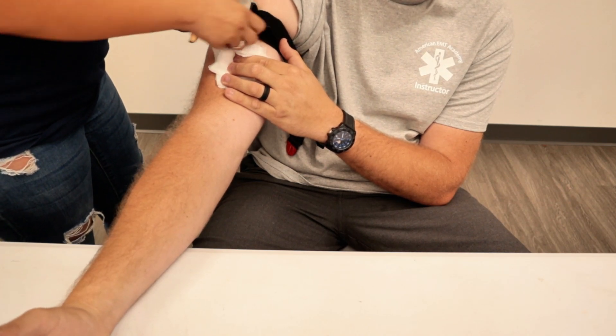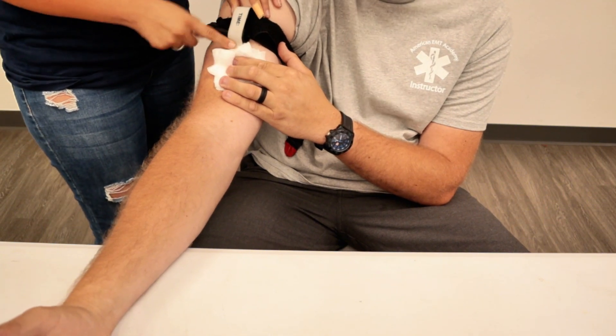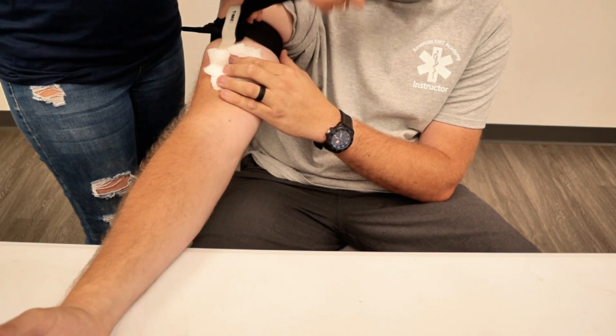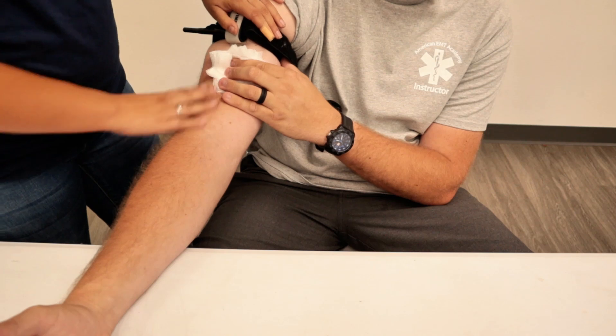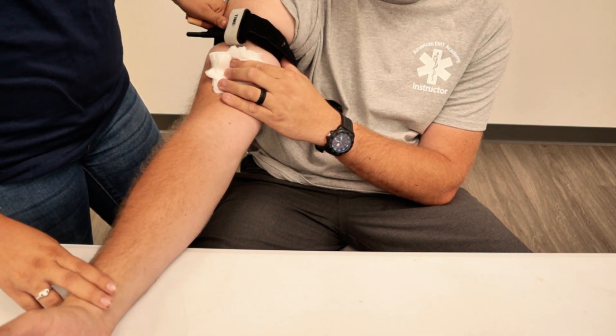We're going to seal it and write the time, then we can go over it. Once blood flow has ceased and you no longer feel a pulse distally, that's how you know the tourniquet is doing its job.